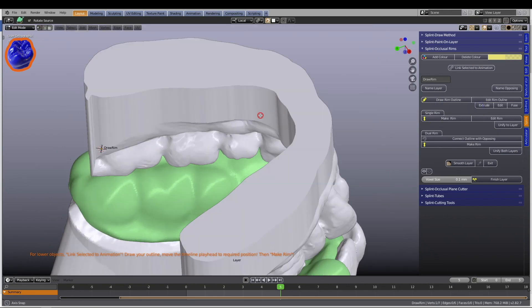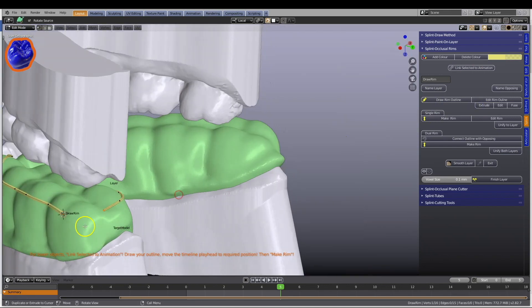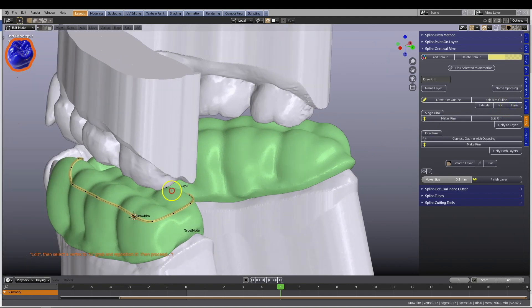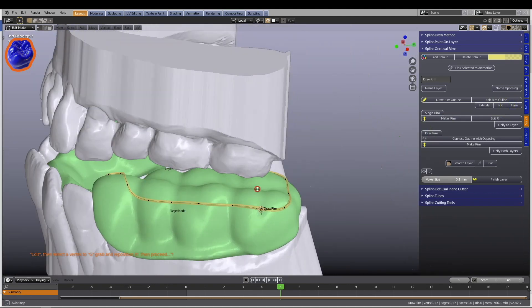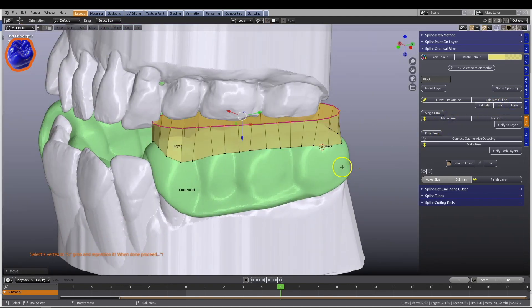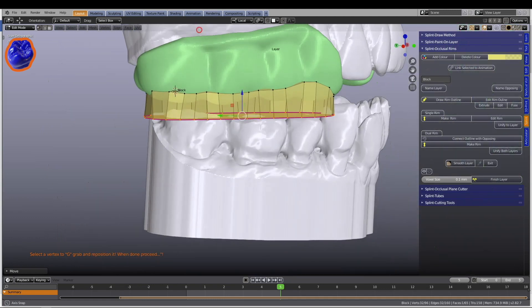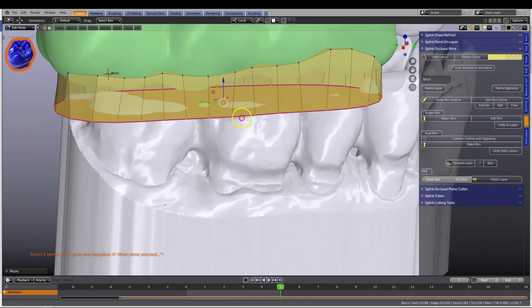The Splint Designer is capable of designing many different types of splints, as well as some other removable appliances. The module includes all the learning tutorials to show you how.